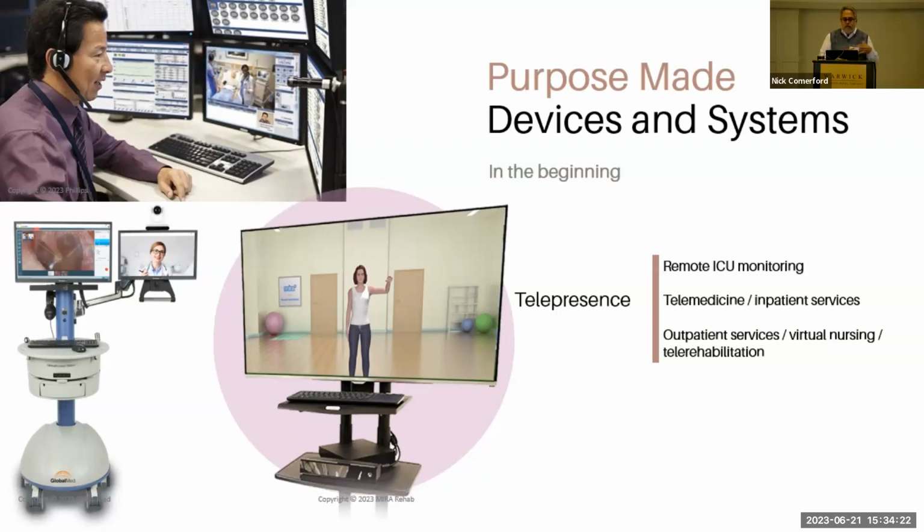But if you look at bringing in this device, it typically has to be cleaned after every use, and then it either has to be stored somewhere. They're not kept in the OR during surgery. So you have this part of the workflow that's not any of your primary use scenarios by far, but it is the number one reason why the adoption hasn't been there. It's why the nurses and the techs do not like using it.